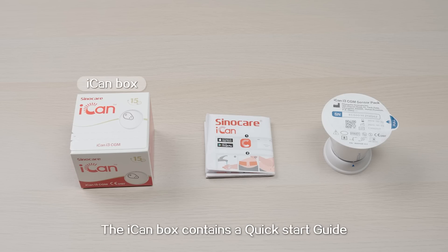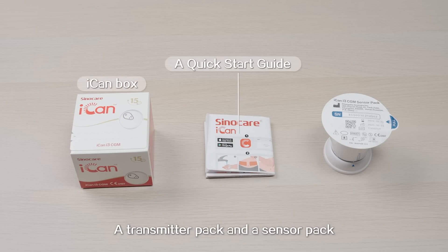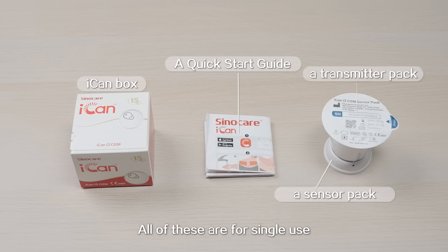The ICANN box contains a quick start guide, transmitter pack, and a sensor pack. All of these are for single use.